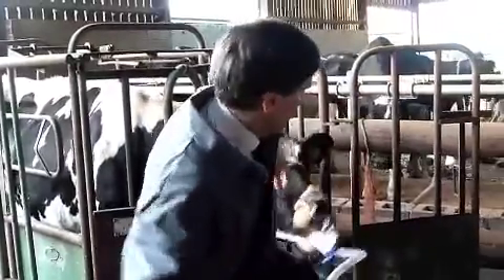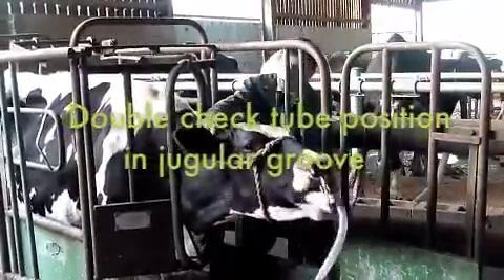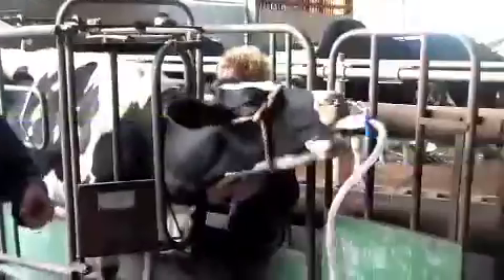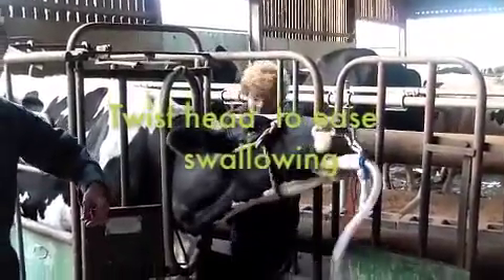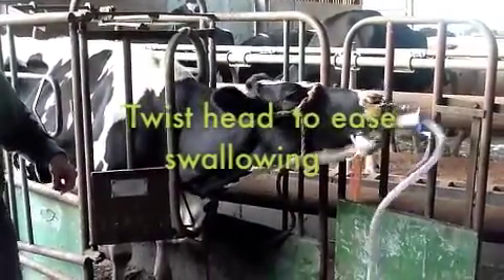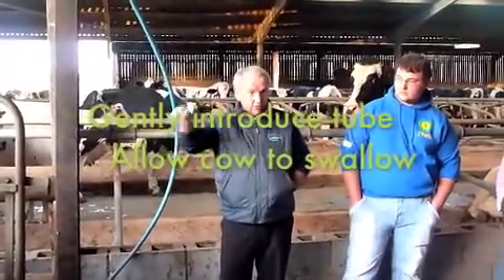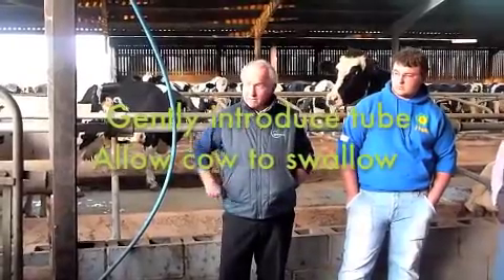What I like to do is come round to this side and feel in the jugular groove. Turning her head to the right the way I did helps, and doing it gently, not aggressively. Just give her the opportunity to swallow it. It's very difficult to go down the airway — we try to do it all the time when trying to anaesthetise them for some reason, and it's ever so difficult. The natural way is to go down where we want it to go, and as long as you don't force it she will swallow it. Running it down too forcefully is most often the problem.